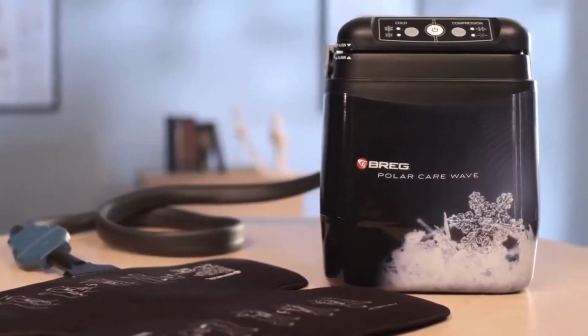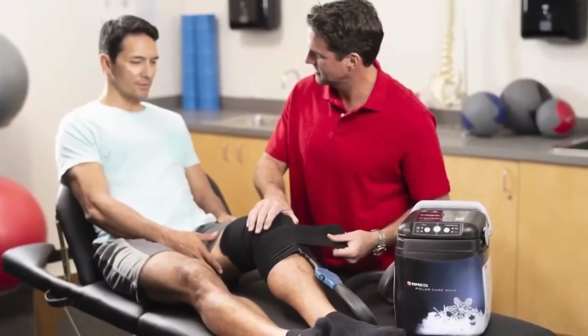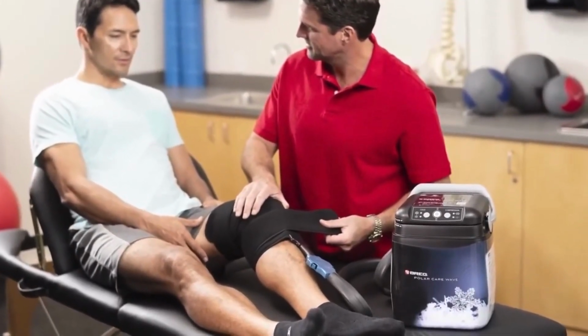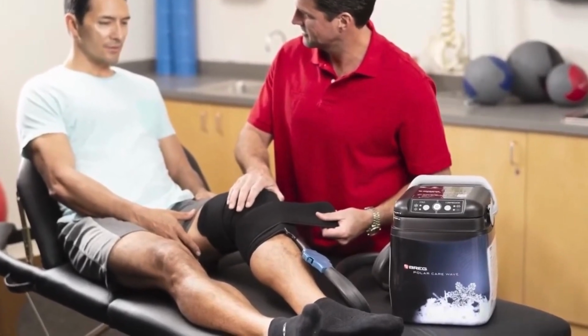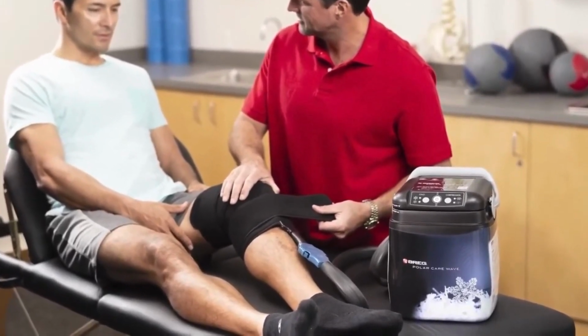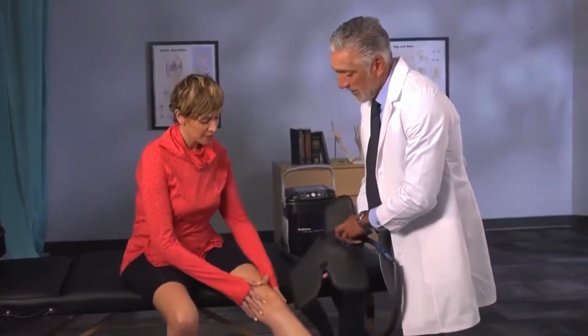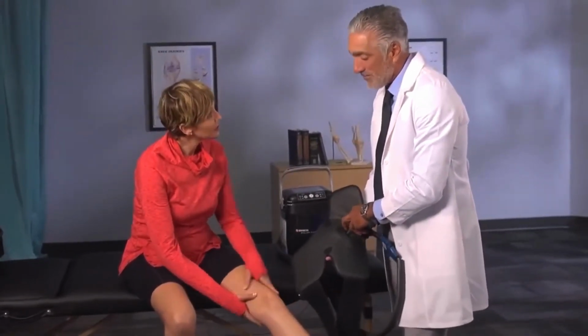Be sure to use the Polar Care Wave system as prescribed by a licensed healthcare professional, including device settings, how often, and how long to apply cold and compression therapy. Your healthcare professional will also prescribe how often to take breaks from cold and compression therapy.